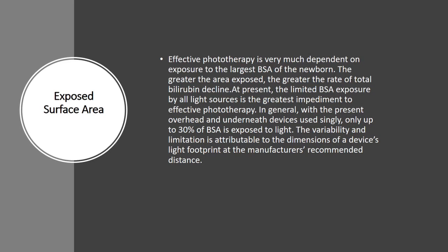In general, with the present overhead and underneath devices used singly, only up to 30% of BSA is exposed to light. The variability and limitation is attributable to the dimensions of a device's light footprint at the manufacturer's recommended distance.